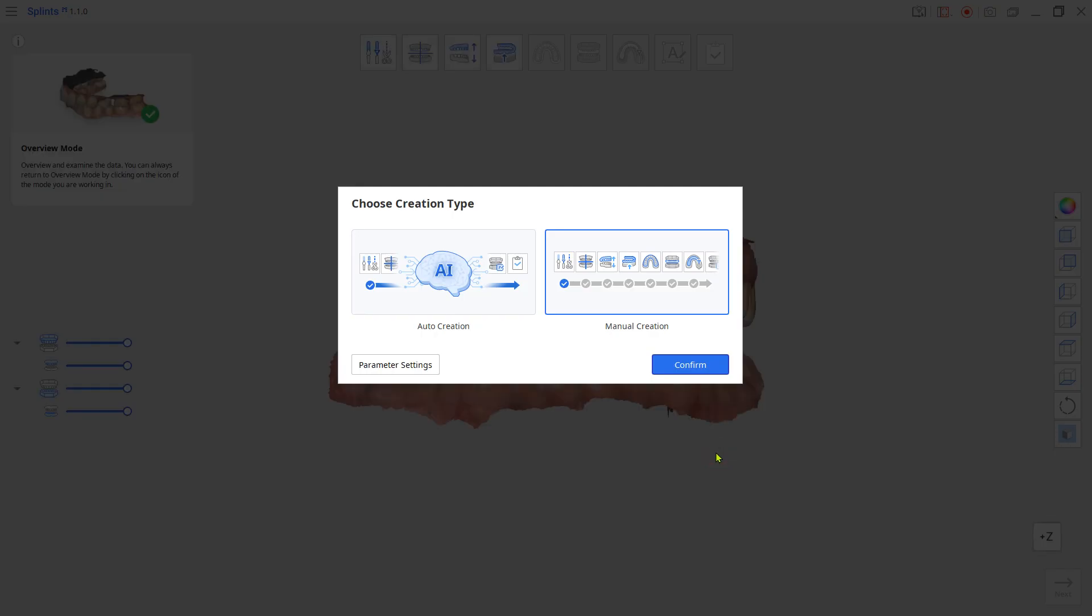Go to Manual Creation. Note, if this is your first time designing a splint, it is always a good idea to design the splint in Manual mode first, because the system will remember the parameter settings that were made during the manual design and save it as the default. This will be beneficial when you design a new splint in Auto Creation mode.